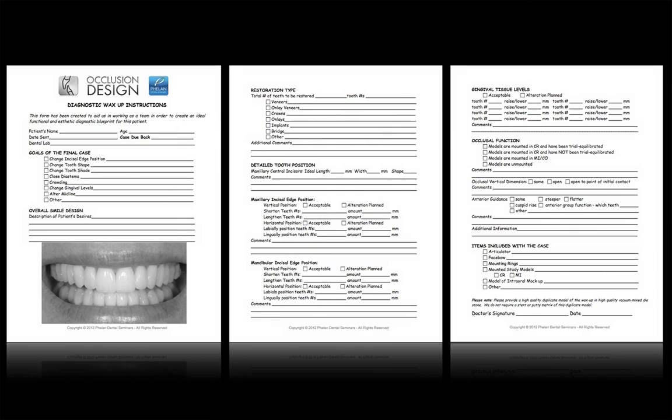And so I designed my diagnostic wax-up communication form to enable my ceramist to really have the vision that I have and that the patient has for the case. I did share this with a lot of people when I was promoting my occlusion design course a couple of years ago, and I think it was really well received. People really liked the concept, and I just wanted to add this to my Dental Excellence video series.